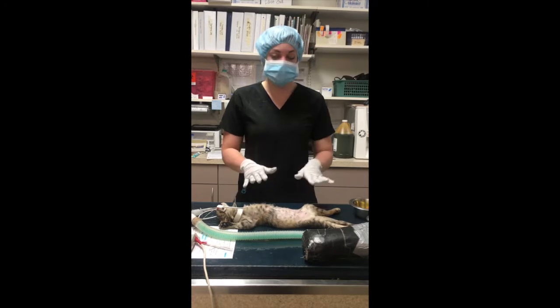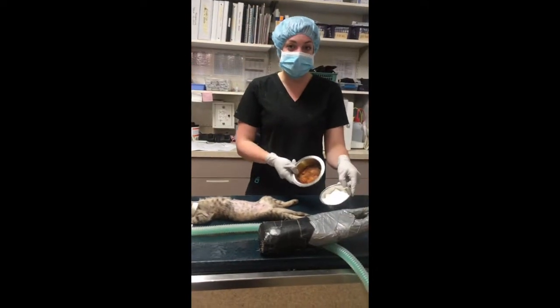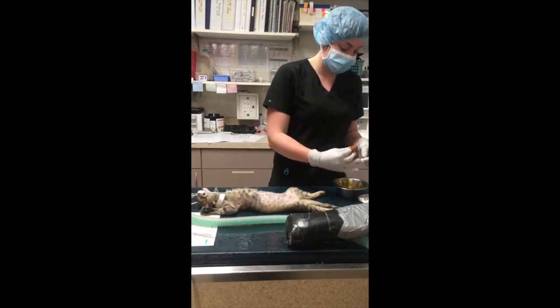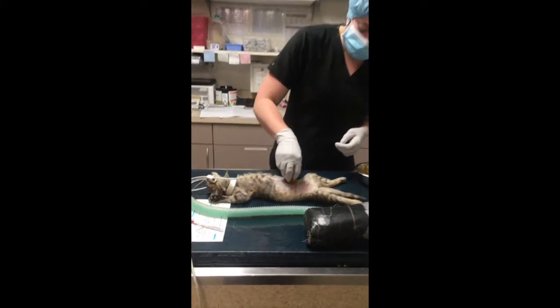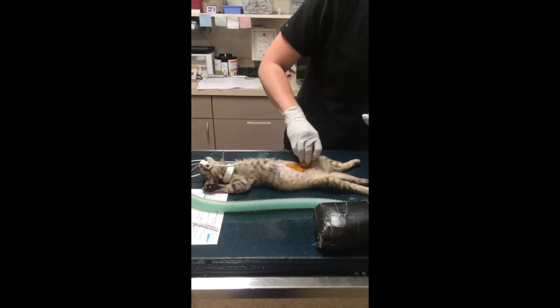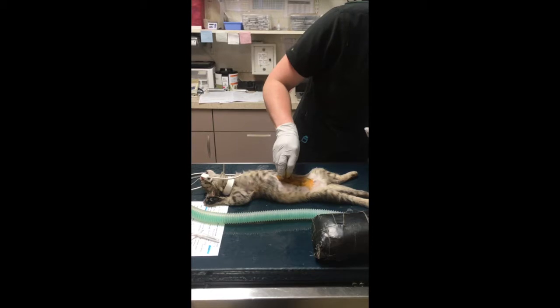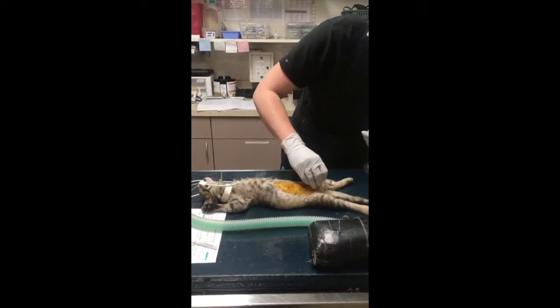Now that we have her clipped and her bladder is expressed, I'm going to scrub her. I am using a betadine and alcohol scrub. I'm going to grab my betadine, and we're going to do 3 of each. You want to use a target style scrub, so you're always rotating your scrub so as not to contaminate the inside, where the sterile procedure incision is going to happen.